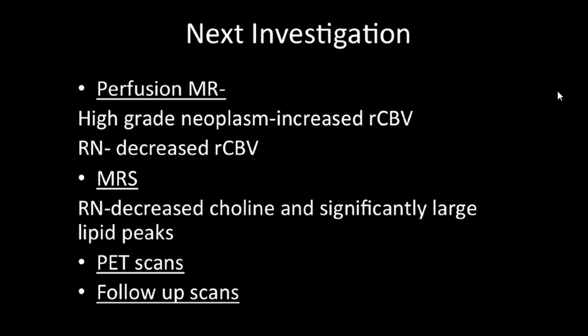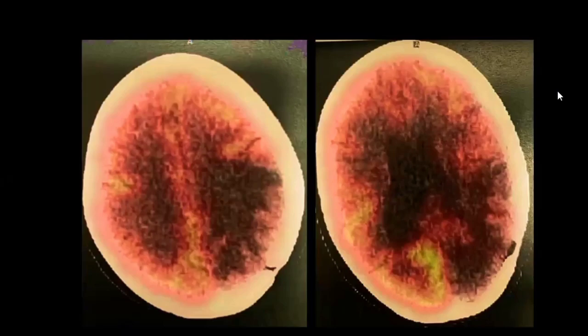In this particular patient, we had a set of follow-up images on which we could see that the edema was increasing and the enhancement was very bizarre. So on the basis of follow-up scans we decided. Similarly, this patient had a PET scan as part of her metastatic workup for CA breast, as advised by her oncologist. Can you please explain these PET images?